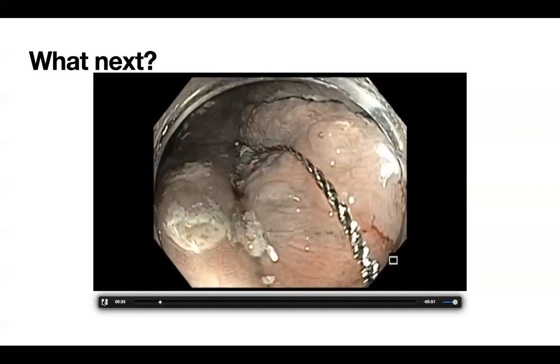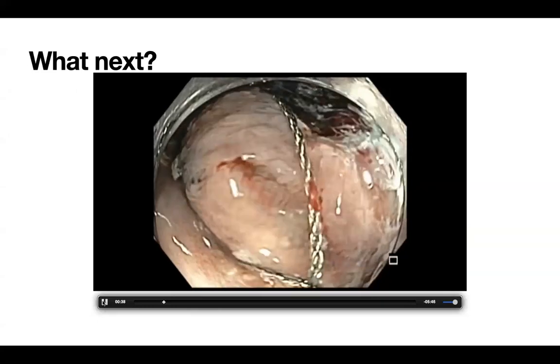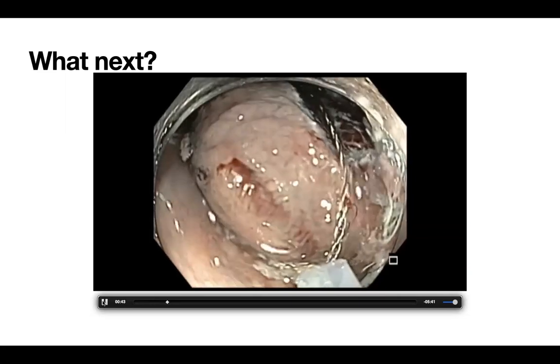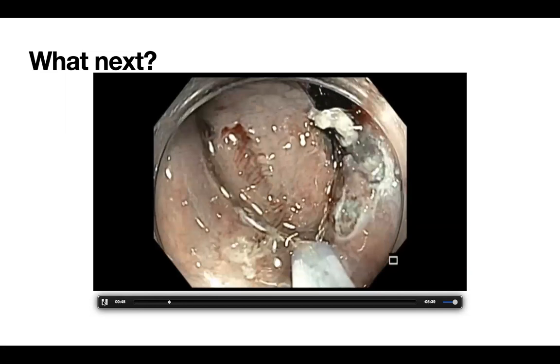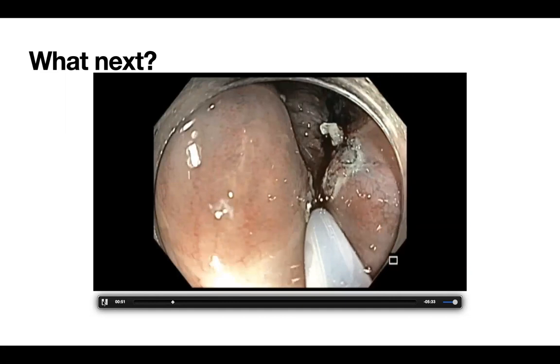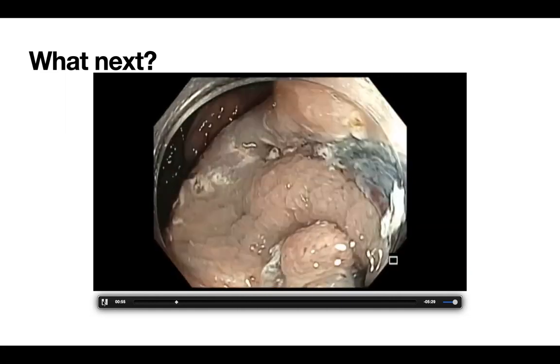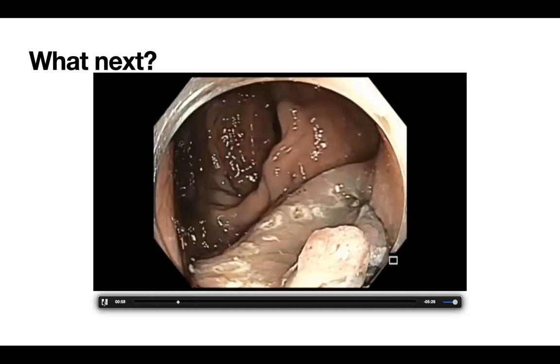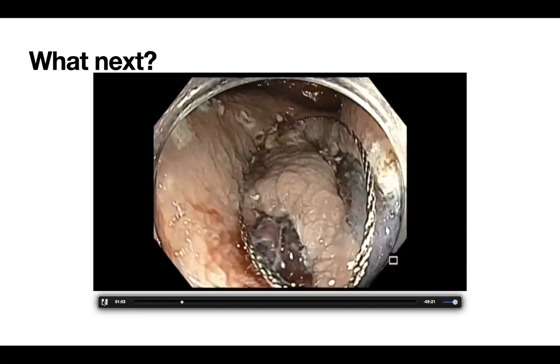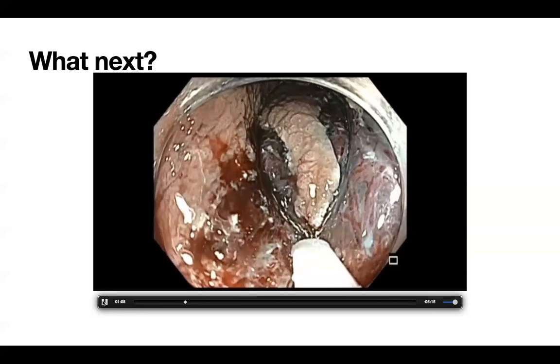Zubair and others, you will notice that as you are cutting the polyp, you need to have some patience. Whenever you think you are closing the snare and will get a nice chunk of tissue, it's also possible that the snare can keep on slipping, which can be very frustrating. I thought my cut should be a large cut, but it's only a small segment, and whatever segment comes, you take.